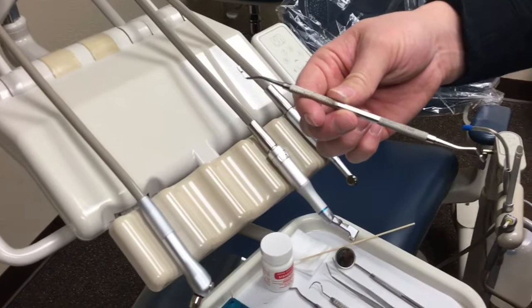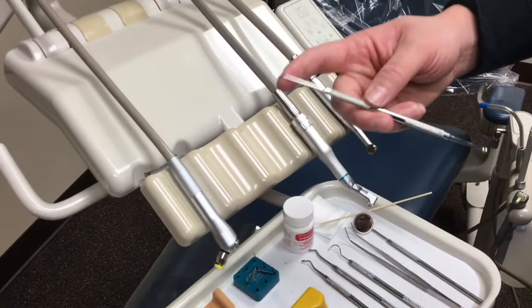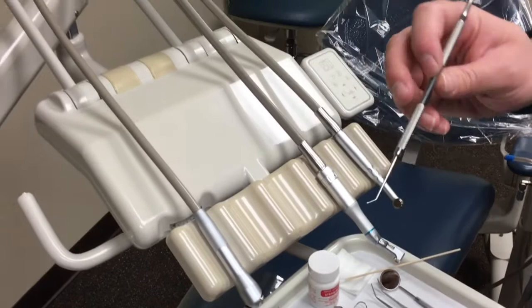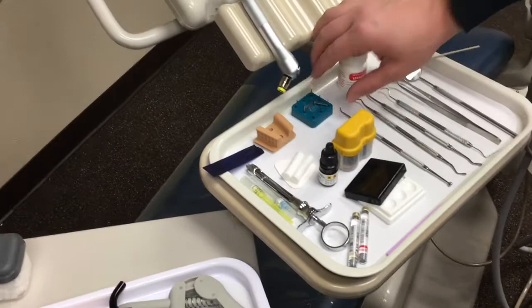Condensers are used to pack in the flowable or the packable composite for any restoration that we'll be using packable on. The next thing is a ball burnisher — on one side we have a little ball, and on the other side we have a football shape. These are used for burnishing the interproximal surfaces — mesial or distal — when doing any type of class two caries procedure. Sometimes doctors like to use them as pluggers for class one or class five as well, so it's always handy to have one out.